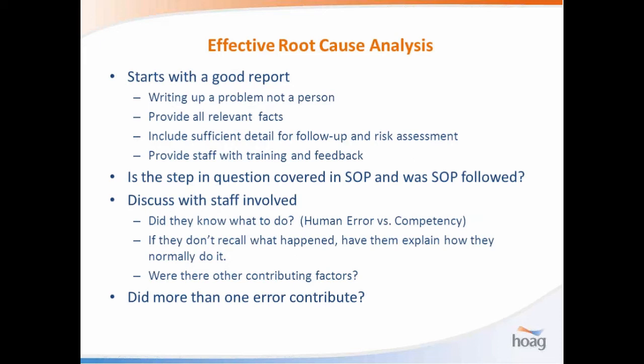So let's transition now and talk about what makes for effective root cause analysis. It always starts with a good report, and that's to write. One of the things we have to instill in the staff is that you're writing up the problem, not writing up the person. I can guarantee you when we first rolled out particularly the general lab OTIS program, we got a lot of tattletaling, and this person didn't do this, and it was very personal, and we've had to really stress to them that we're after the problem so we can examine the system. This is not a means for tattling on people or getting back at one of your colleagues.